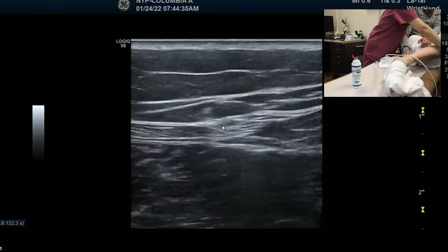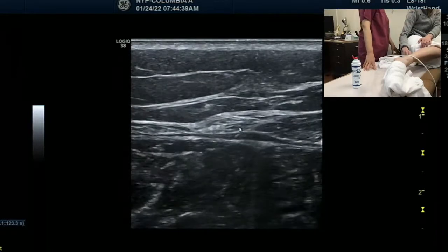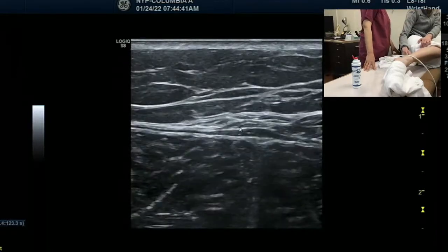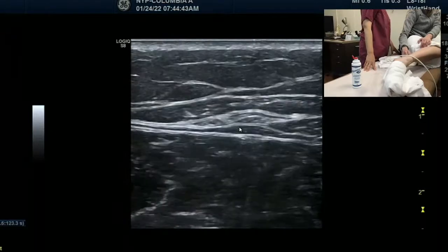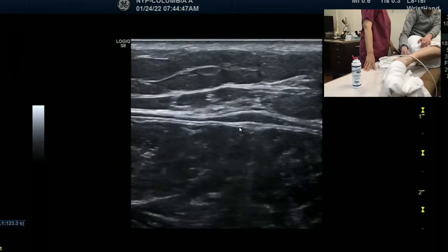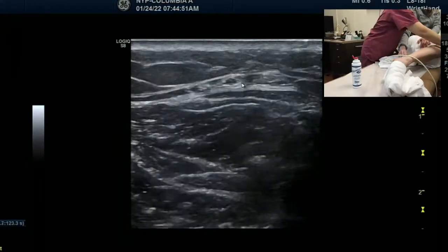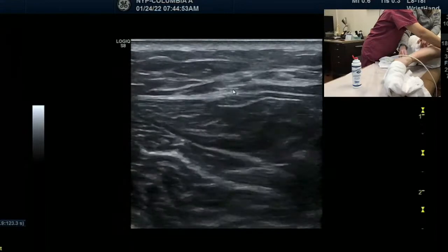Do you think this is the nerve if you just put this probe over there? I think the sural nerve is the hardest nerve. Now it's splitting. See. I think you're going down because previously it was already split, so now you scan down, I can see more. A little faster, so now here. Now you guys saw it, right? And then move up.